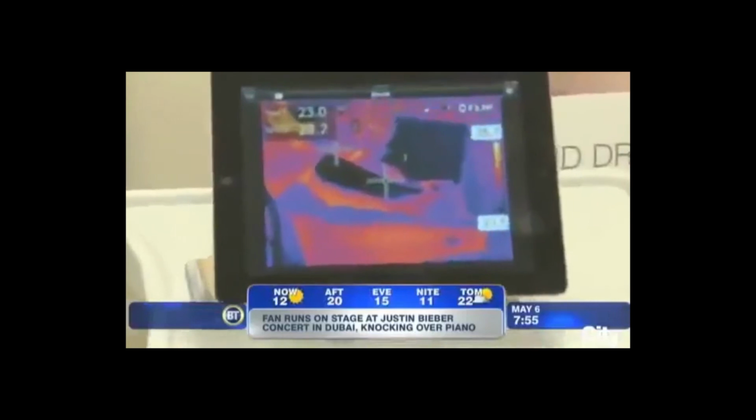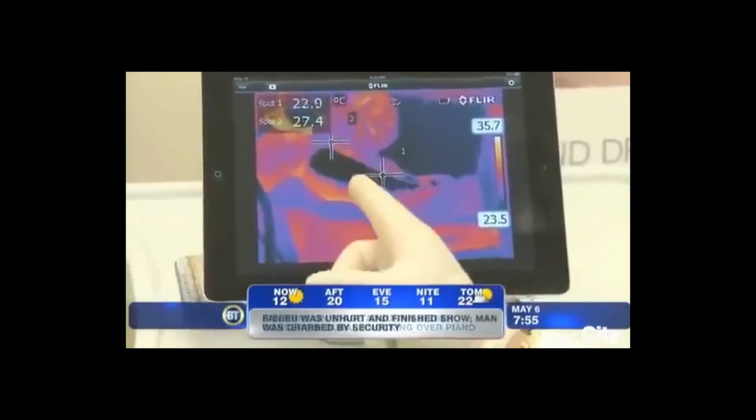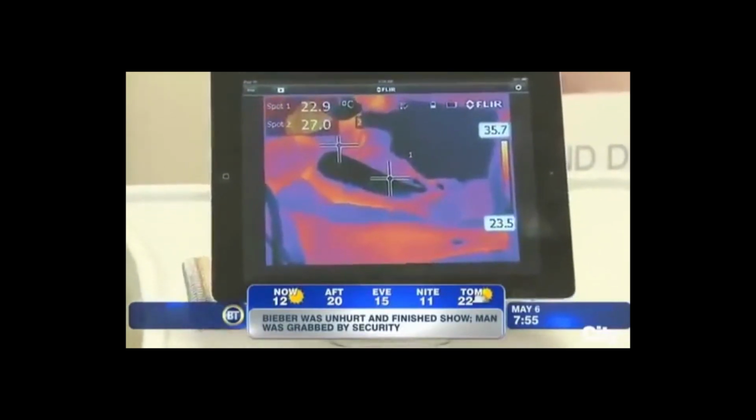Now if we look up to the screen here, you can see the image of her leg, an infrared image. In the other treatment, it was white hot. You can see how it's almost blue to black cold. We basically created an ice cube while we're treating because it's so cold, and then you don't feel the discomfort of the hair reduction. Wow.